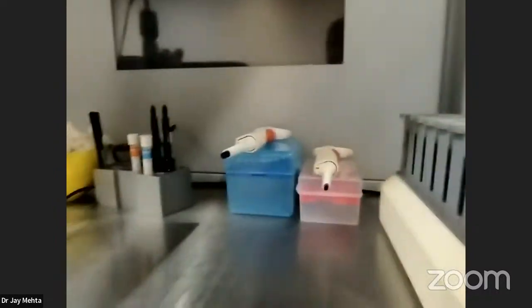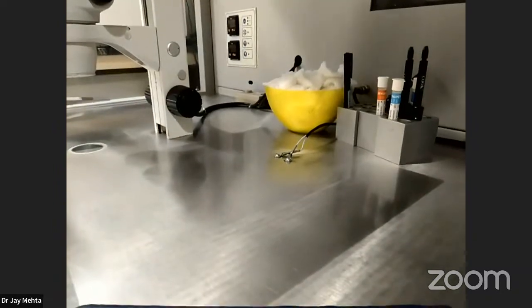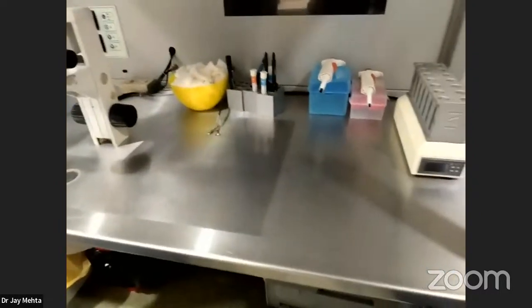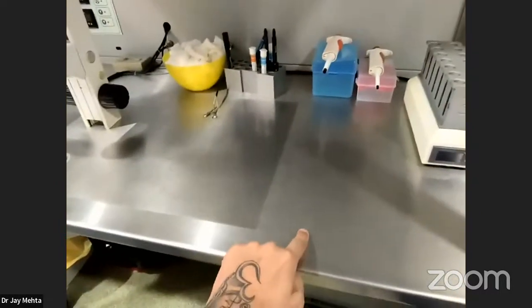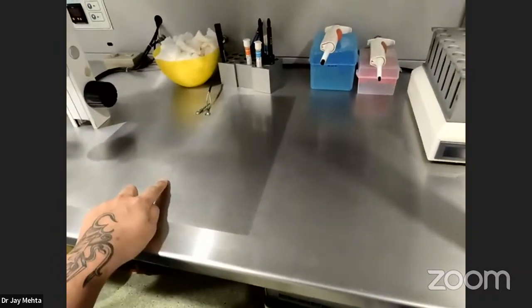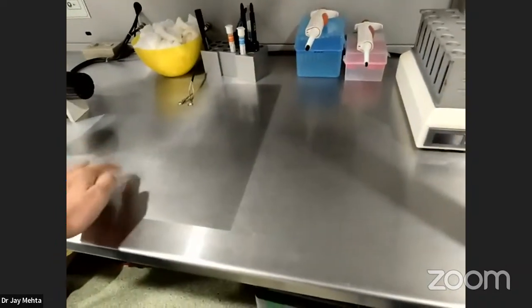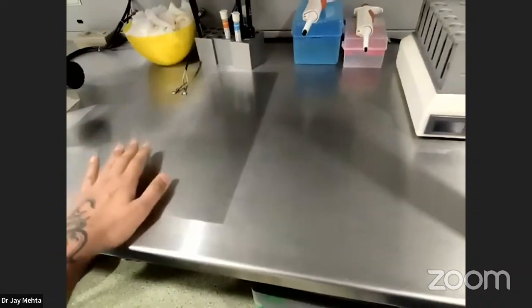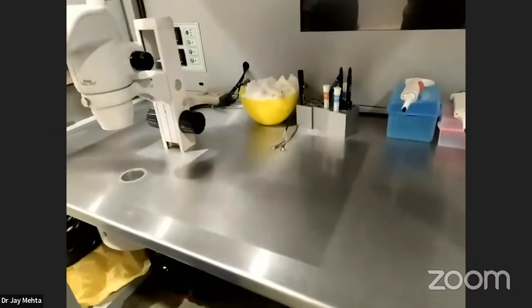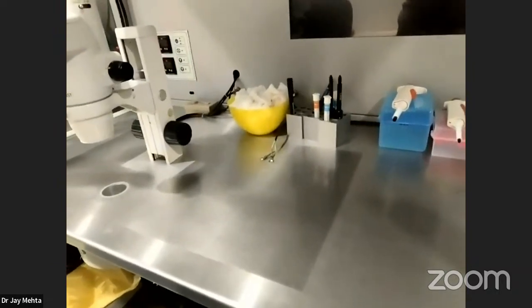Okay, the second important thing is the heating plate which is present on your laminar airflow. If you look at your laminar airflows, they are divided, as you can see, into a non-heated zone and a heated zone. Correct? This is how the division is in almost all laminar airflows. So this heating plate has to be correctly heated. Quite a lot of times this heating plate becomes more than 37 degrees. That is not good. Quite a lot of times the heating plate is less than 37 degrees. That is not good.